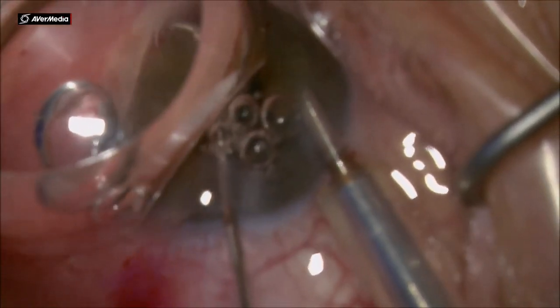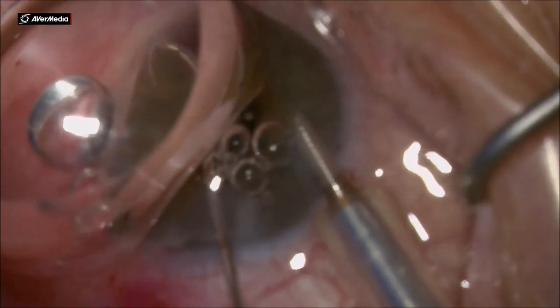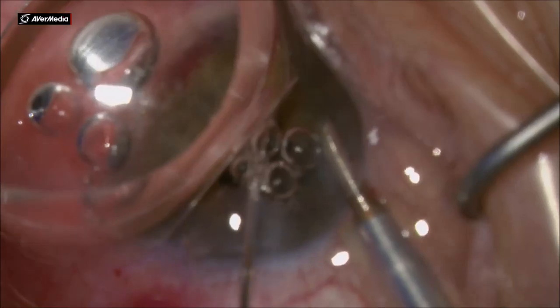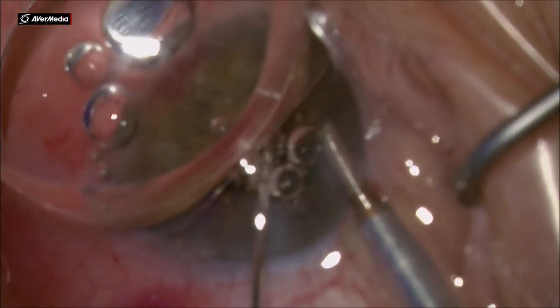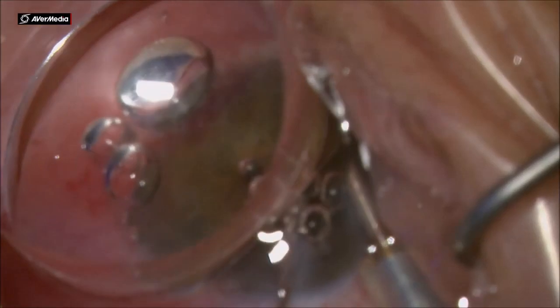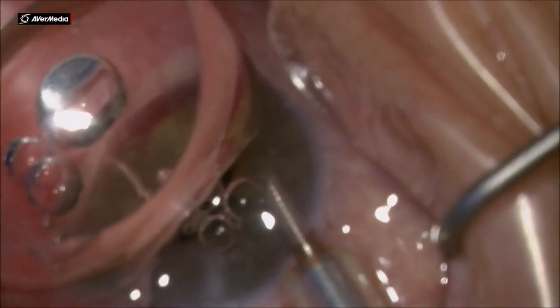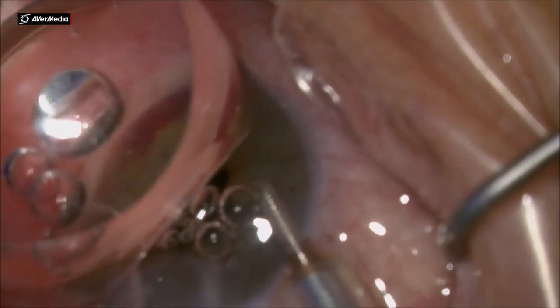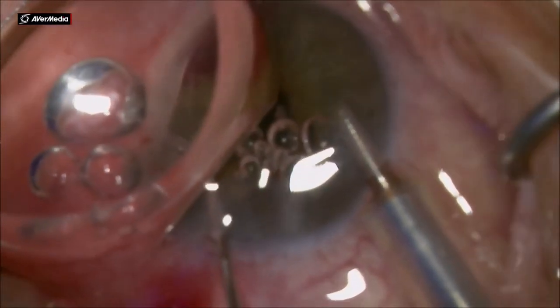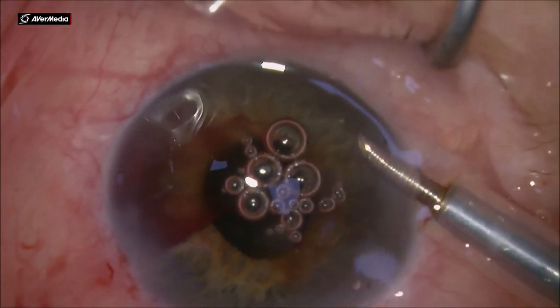I'm trying to cut the trabecular meshwork a little bit and release some pressure on this side. It's not a very high IOP, and that's why I'm not really trying too much to open the trabecular meshwork. I'm still able to open about 60 degrees of trabecular meshwork.